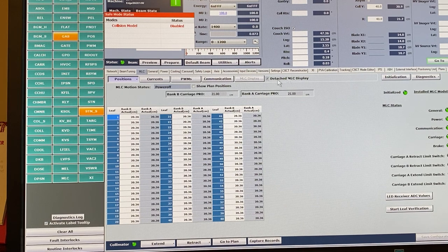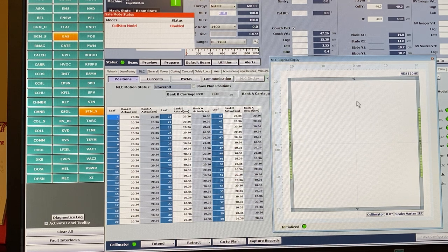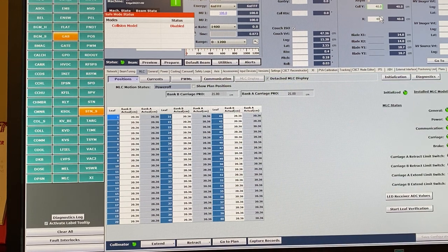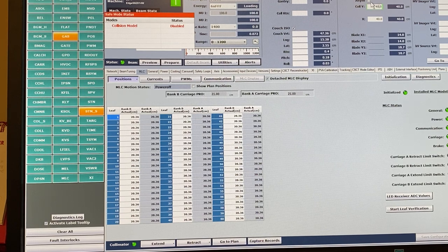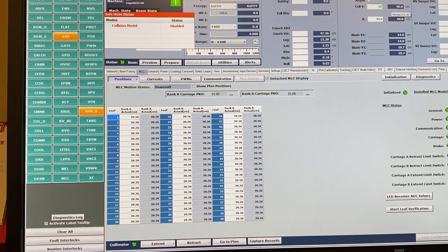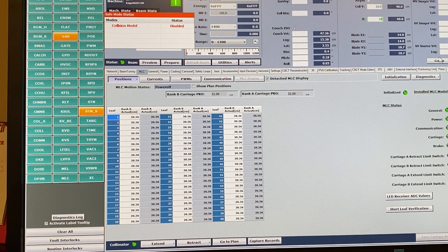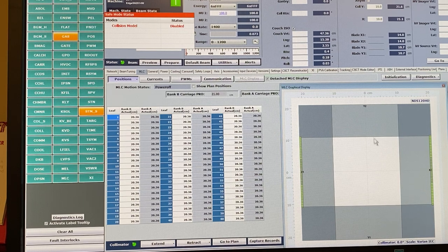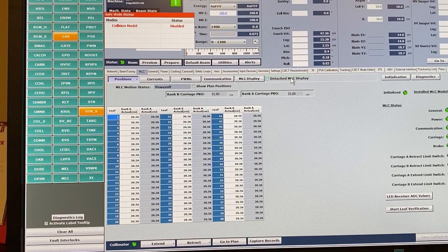Hit Go To and you see the MLCs and jaws move, allowing you to align the ArcCheck or whatever QA device you're using. You can also change field size while the beam is on in service mode. I'll demonstrate: shoot the beam, type in new values, hit Go To, and you can see the jaws are actually moving while the beam is running — though in this case the beam stopped before it reached 10 by 10.